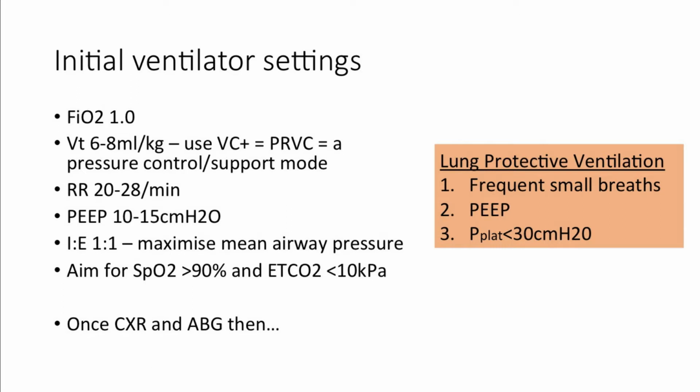So typically in ARDS you have quite stiff lungs with poor compliance and rapid emptying. So far for this COVID, I think that the lungs aren't that stiff, but they are just ineffective at oxygenation. But if they were stiff, then you often have a period of time during expiration that they finish breathing out because they've got a quick expiratory time, and then you've got a long time with no flow, nothing happening. That's essentially a waste of time, and so I fill up that time with inspiration.